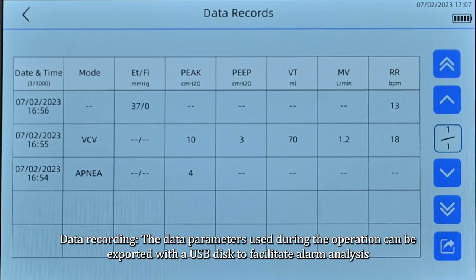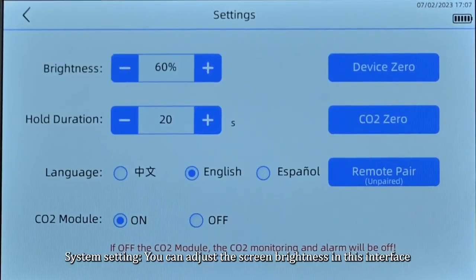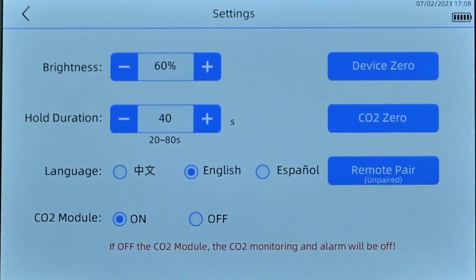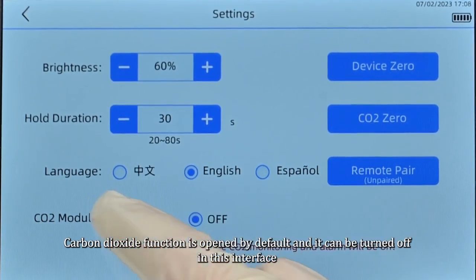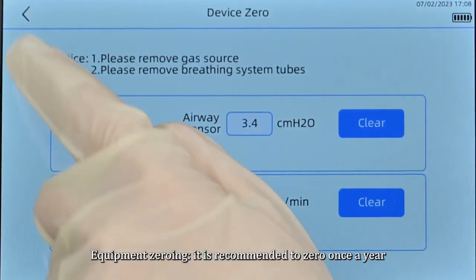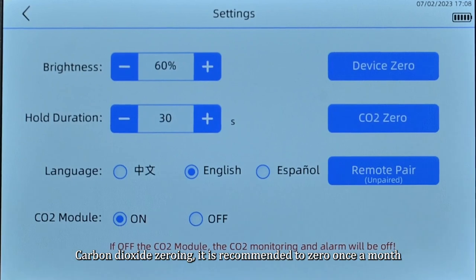Data recording allows the parameters used during operation to be exported with a USB disk to facilitate alarm analysis. In system settings, you can adjust the screen brightness, and set the hold duration time to avoid lung injury caused by pressing the key for too long. The language can also be adjusted. Carbon dioxide function is open by default but can be turned off here. Equipment zeroing is recommended once a year; CO2 zeroing is recommended once a month.